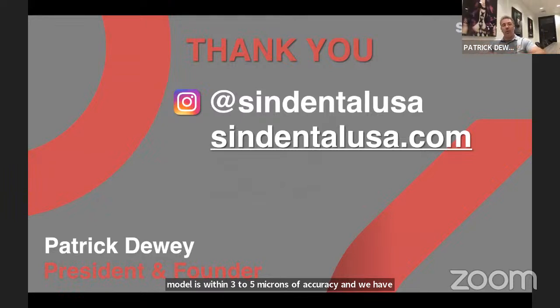What we used that model for, we did 2 scans, one with photogrammetry and the micromapper scan bodies, and then one with the OptiSplint where you lute the scan bodies together, take it off, rescan it, and then you use that for your implant positions. The maximum deviation of one scan body, the most that was outside of the baseline, on the micromapper was 12 microns. So if that model is potentially 5 microns of accuracy off, the maximum that multi-unit would be off from the file that's scanned on the micromapper is roughly around 17 microns of accuracy. So it's still very much in the clinically acceptable zone.